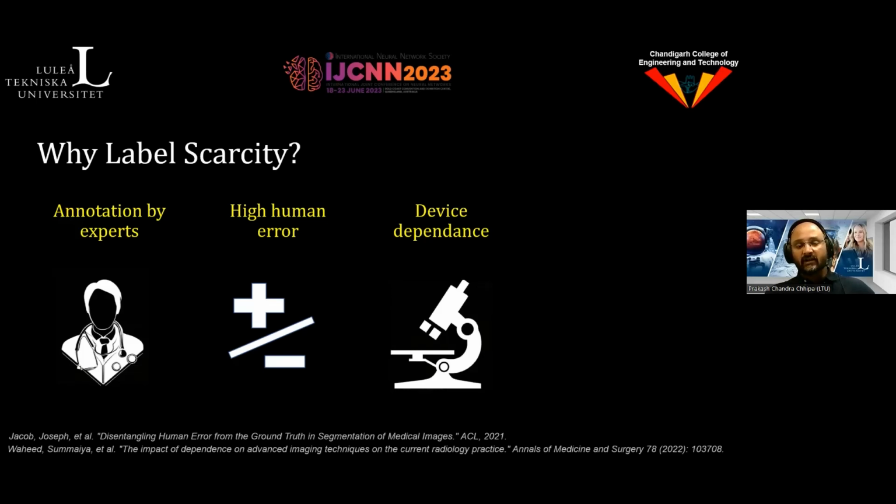So in general there may be multiple datasets, but their different characteristics, such as magnification and operating environment, prevent them from being used in a combined manner.